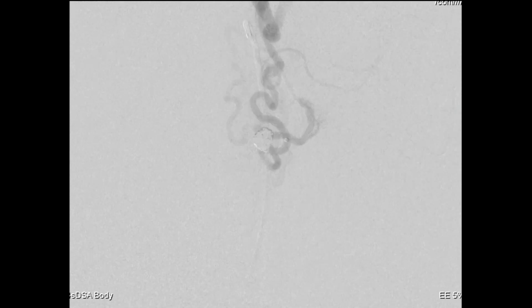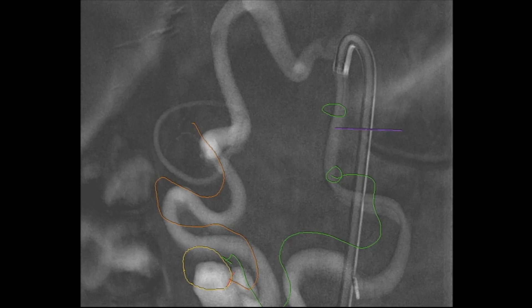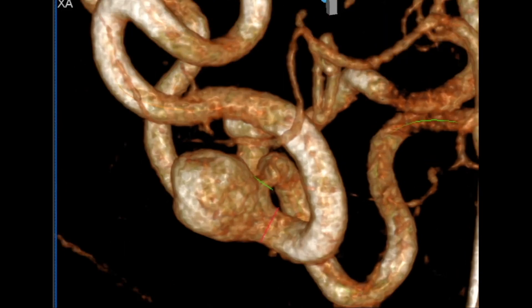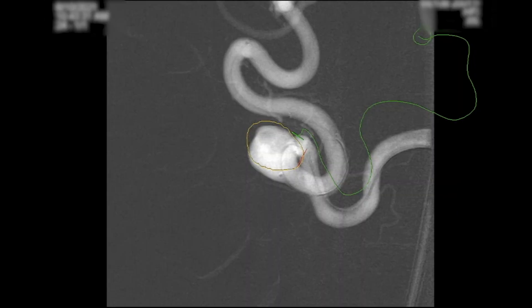We did a completion cone beam CT. You can see the coil packing is beautiful. The cone beam allows us to fuse these images together. We've got antegrade flow continuing up into the hepatic artery. You can see the pre-reconstruction cone beam CT showing what it looked like before, and then once packed, we get a very accurate idea of just how complete the packing has been.